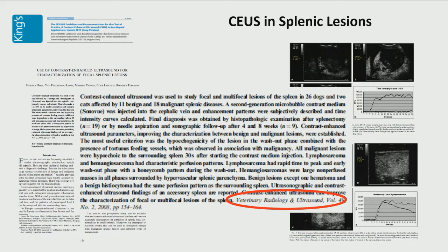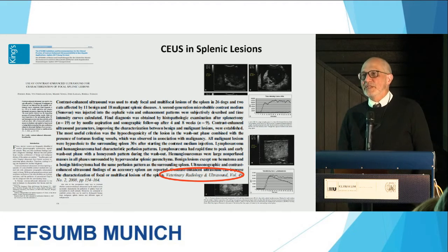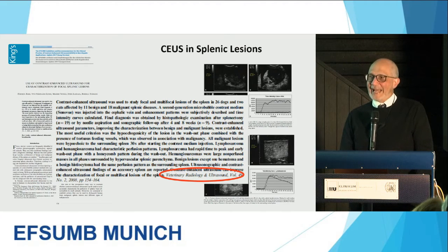And in fact, angiosarcoma is common in dogs. And this is why the veterinary community actually use a lot of contrast-enhanced ultrasound. One of my consultant colleagues brought a CD of his cat from Italy who'd had a contrast-enhanced ultrasound of the liver for me to interpret.